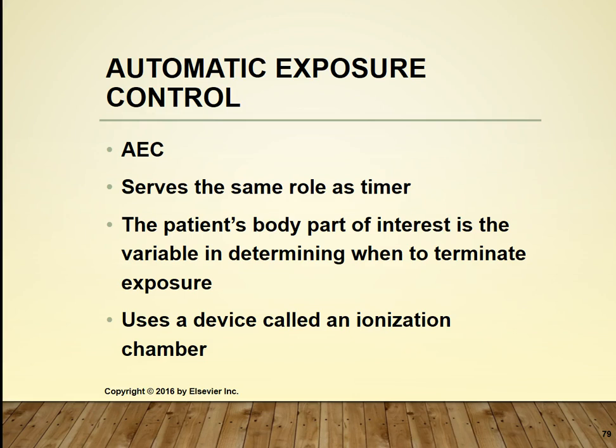The infant. Because of the difference in the thickness and the density of these two patients, it takes longer for x-ray to go through that larger person to make the signal on the chamber to cut it off. So that's why this is very important, and that's why it's on the primary circuit, because all of this has to do with making that initial exposure.